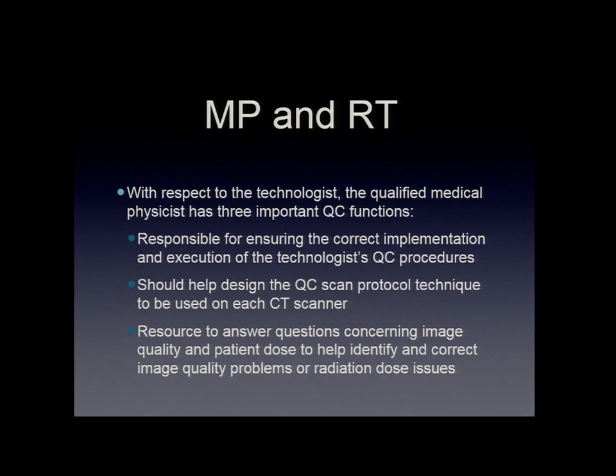So the physicist has to work with the RT to establish the quality control program, and that may be just going through and training them on how to implement the ACR's program or the IAC's program or whatever program they agree to come up with that is applicable to the clinical site.